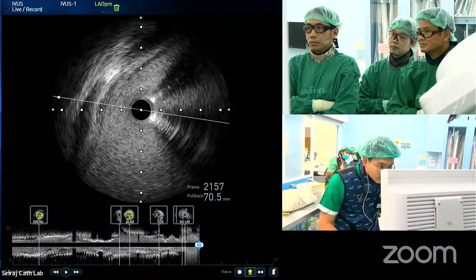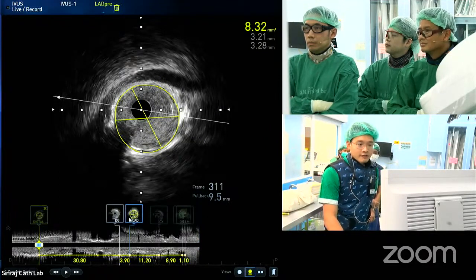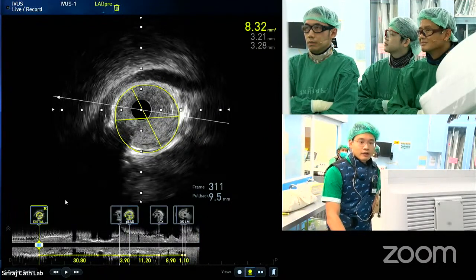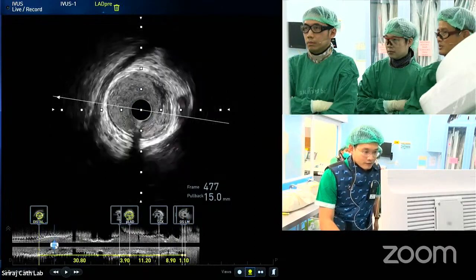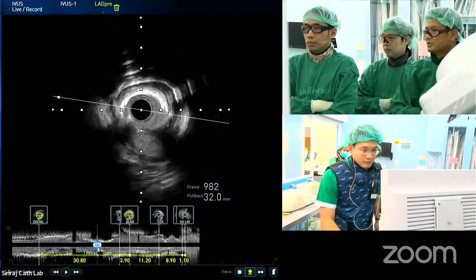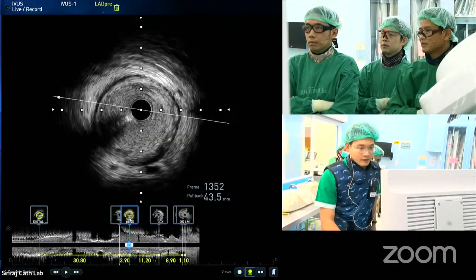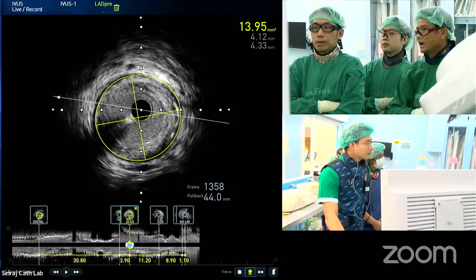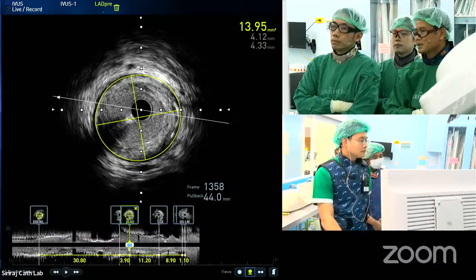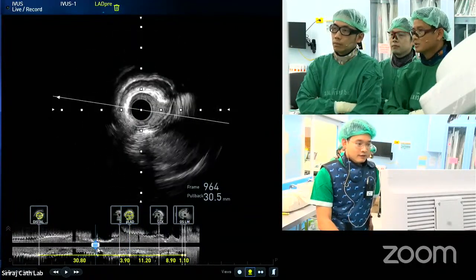And from this view, look at the distal reference here. The distal LAD, the diameter from the vessel's EEL is 3.2 over 3.2. So usually about 0.8, so maybe a 3.0 stent up to 30. Yes. But we need to prep the lesion quite well before putting the stent, given that superficial calcium. It's not a high calcium score, because it's not 360, but it's circumferential at 180. So yes, we need to prep it well.